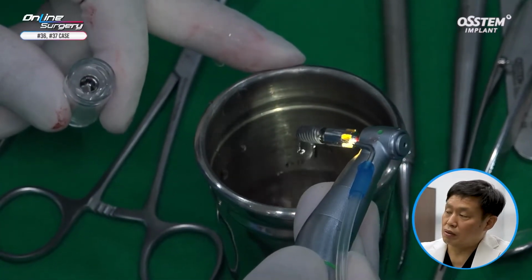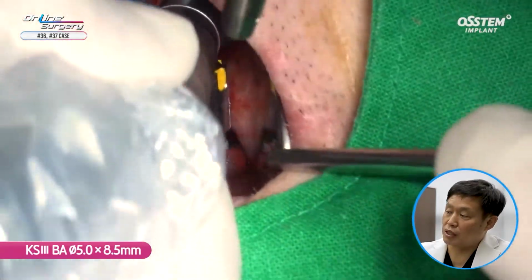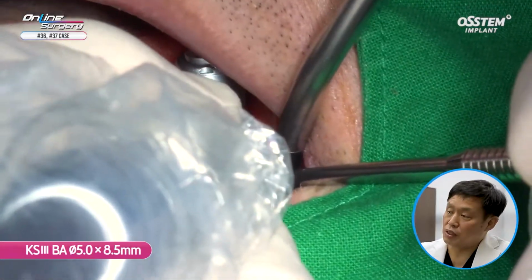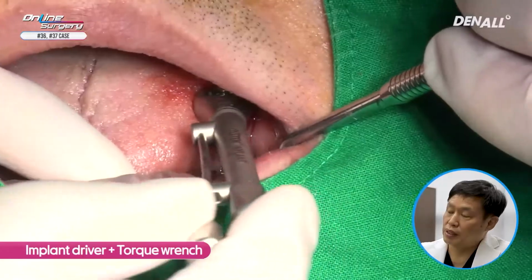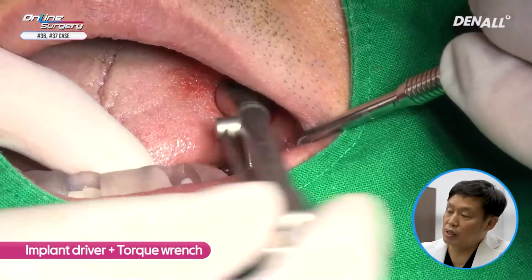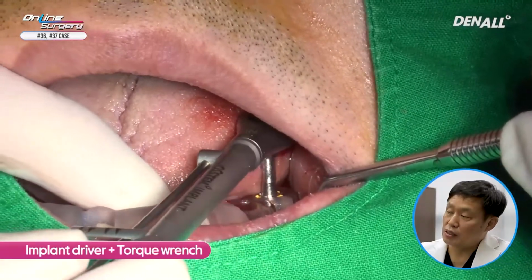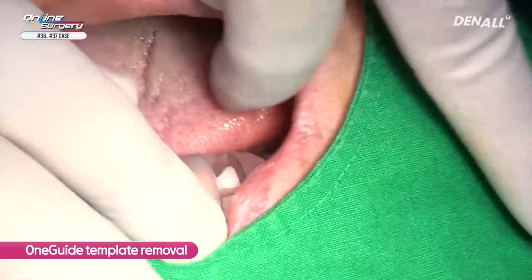Next, KSⅢ, 5.0 by 8.5 millimeter implant is used. Sufficient irrigation is done. Implant is being positioned. Implant is placed about 80% with engine, and implant driver is used for final depth adjustment. Primary stability is good.